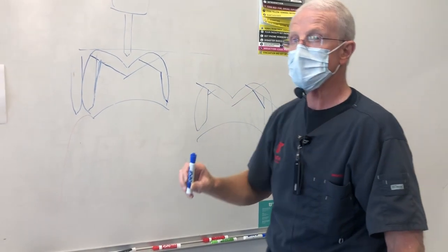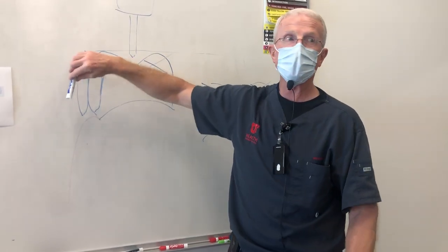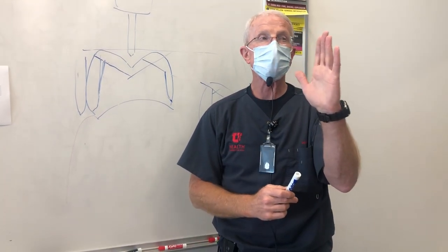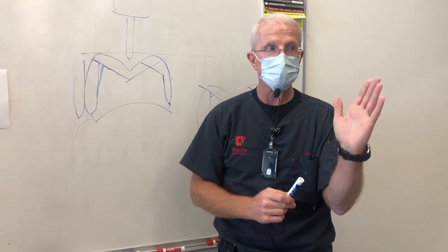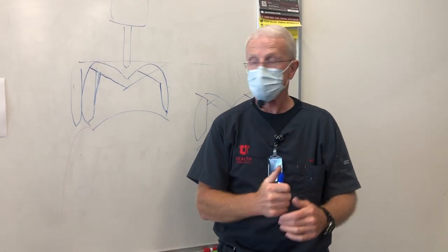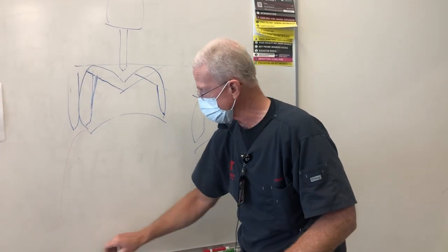Okay. Yep. Any others? Those are all really good questions. Hopefully that clarifies, especially the way you line up your buccal axial wall, because that's the one that lines up the axis of your entire preparation. The side of the burr does the cutting, and keep checking your axis, and as you start to engage the tip of the burr, then start bringing it gingival to get to the right axial depth and gingival height. You'll arrive at both those at about the same time. Okay, good.